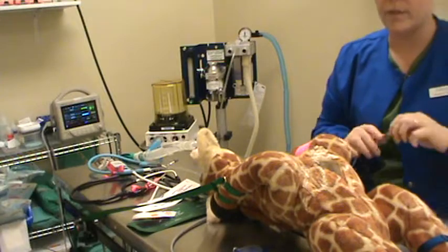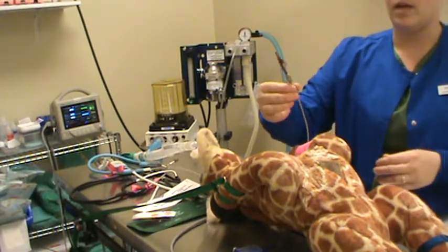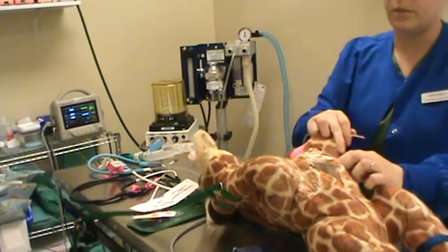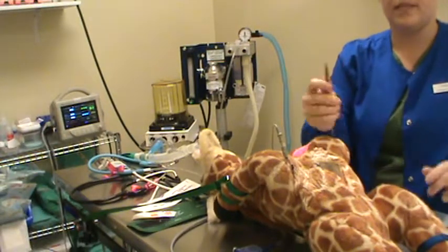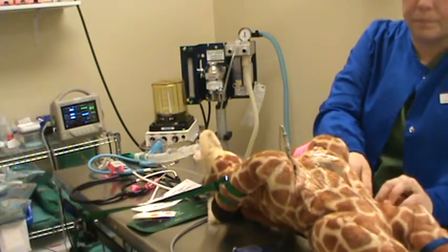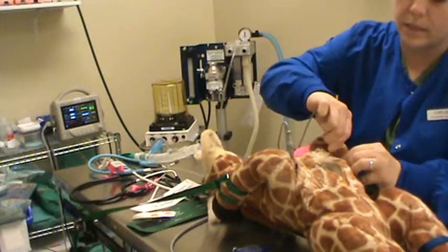First thing I'm going to hook up here is the ECG leads. They're really important in monitoring the heart rate and rhythm. We have our white lead here, and white goes on the right, which is the right side of the patient over here. We're going to clamp that down. Then we have our red lead here, and red is the left inguinal. And we have our black lead, and black is the left axilla.